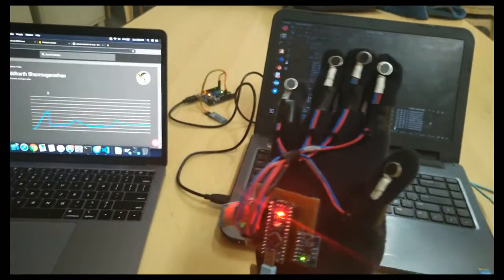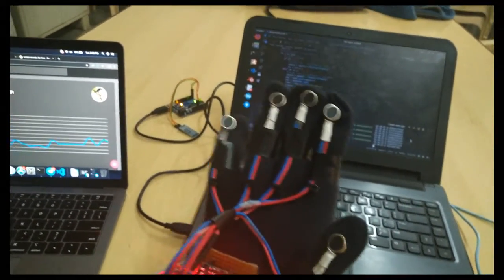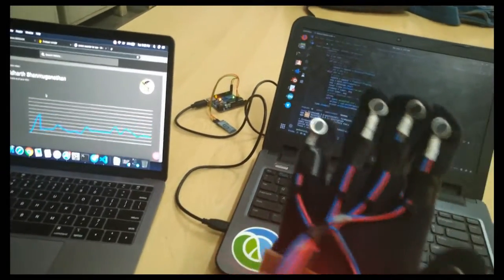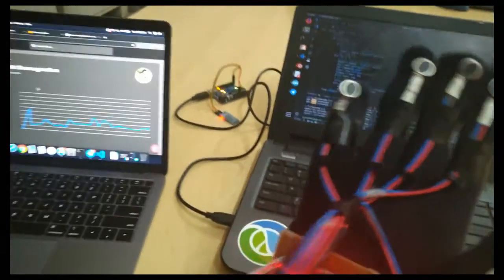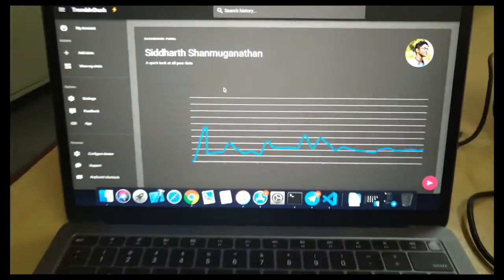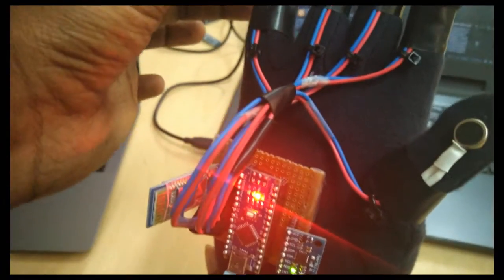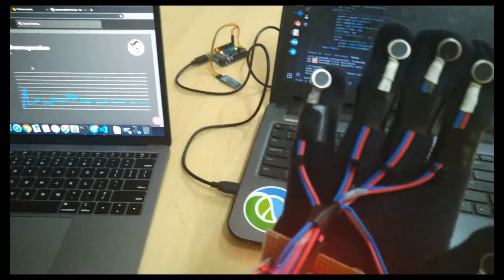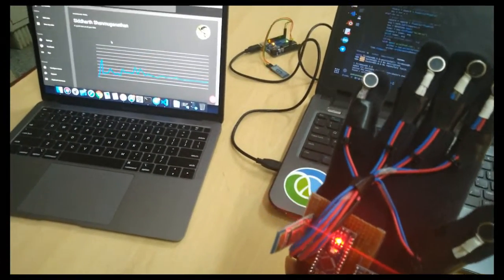The system works this way. The coin motor generates the counter vibration which will eliminate and control the negative impact of the normal hand tremor, and that data is sent through Bluetooth to our server, and from there, from the cloud, we visualize this data right here on the screen. One would definitely appreciate it if you have it in the hand, because you can feel the vibration. The moment you keep it here, you can understand that there is a vibration generated in each and every coin motor, and that's generated based on the original tremor that your hand gives.